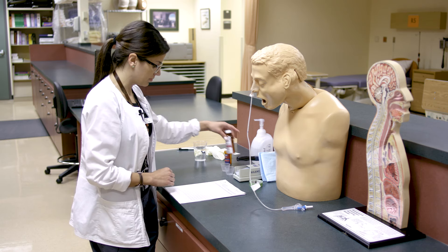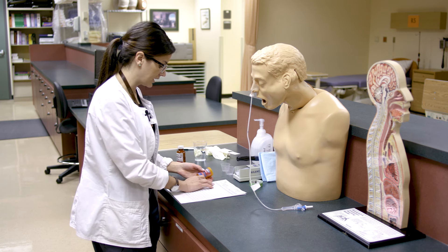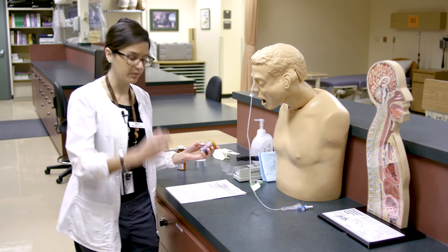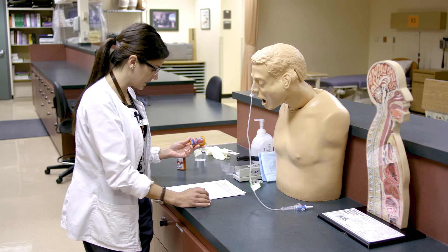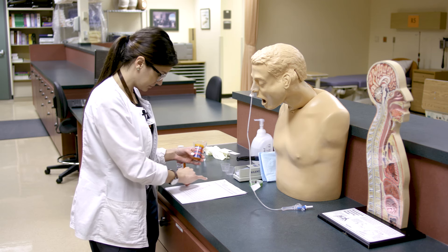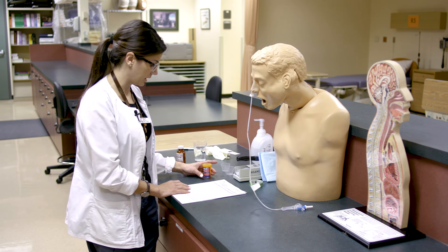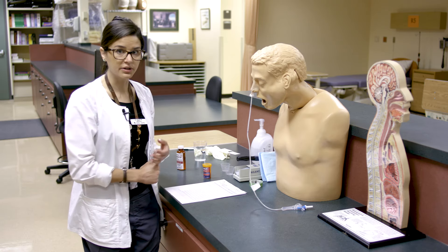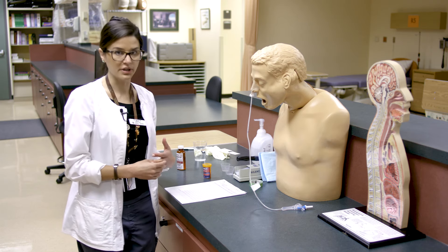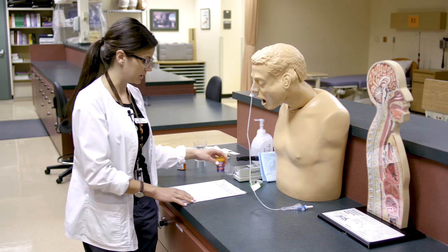The second part of our first check is confirming we have the right medications. Benadryl and diphenhydramine are the same thing — often it will say that on the package, but you'd want to know that with your drug cards. The dose is 25 mg, so these are each a 25 mg tablet. The route is per nasogastric, so we need to make sure we can crush these. You want to confirm it's not enteric-coated, not a long-acting or contin medication, and not something unsafe to crush like a cytotoxic medication.